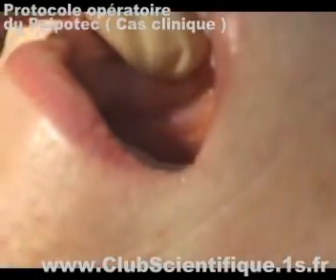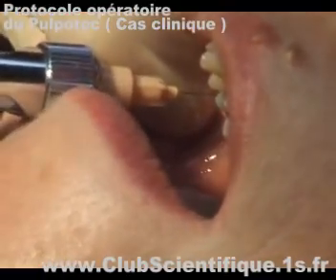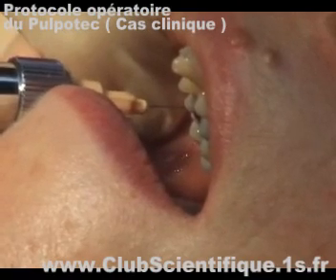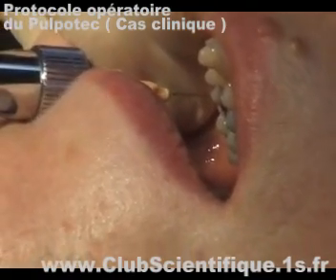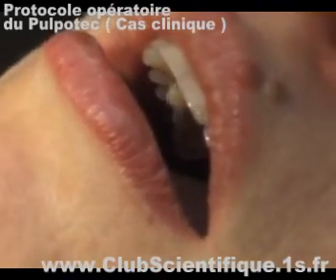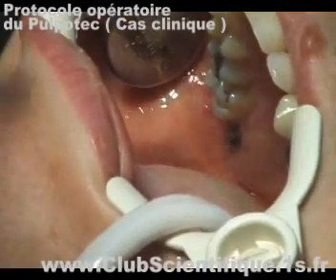As a first step, a local anesthesia needs to be made. Then, the roof of the pulp chamber has to be removed with an X-long surgical burr number 200.